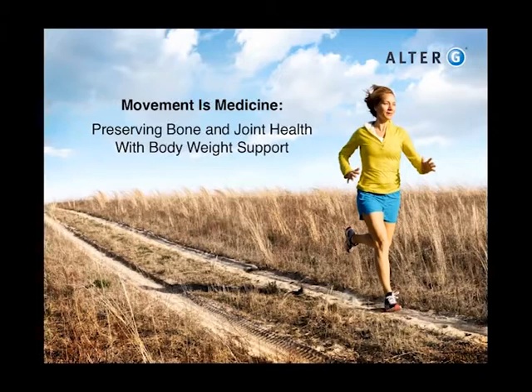If they can withstand loading for bone, they need to have stimulation according to Wolff's law. So I don't want to remove all the weight. I want to make sure that they're at a comfortable body weight. So I start at 50% and I go up or down based on the patient.